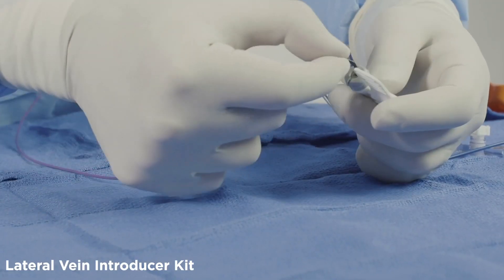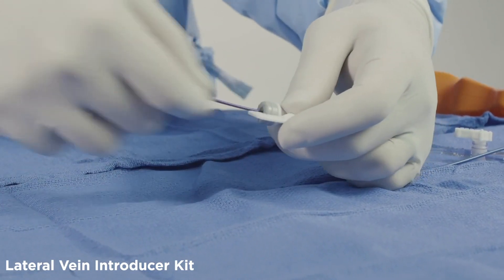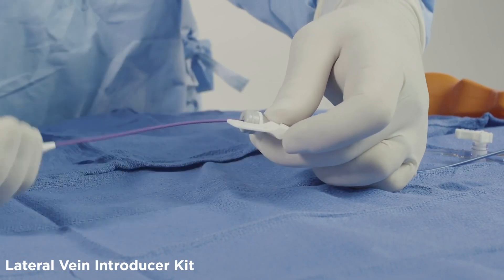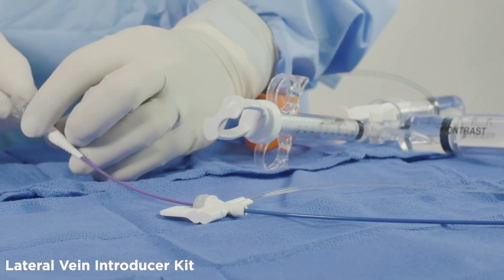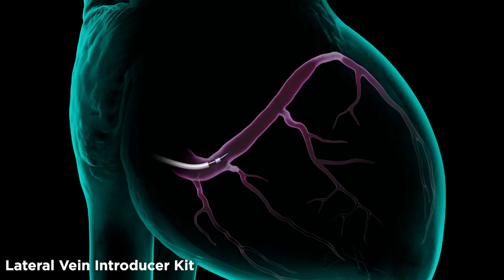Pre-load the vein selector inside the lateral vein introducer until the distal tips are aligned. Place the contrast kit on the proximal end of the vein selector. It is now ready for use. Advance the LVI and vein selector together through the CSG until all three distal tips are aligned — this can be seen under fluoroscopy. Advance the vein selector into the target vein and verify catheter location with puffs of contrast.